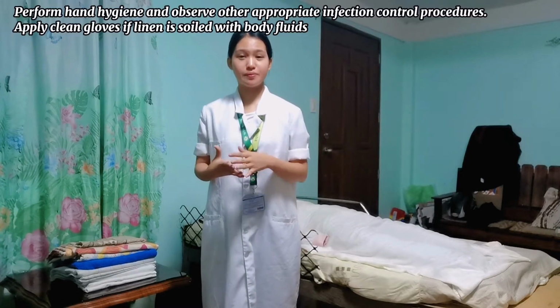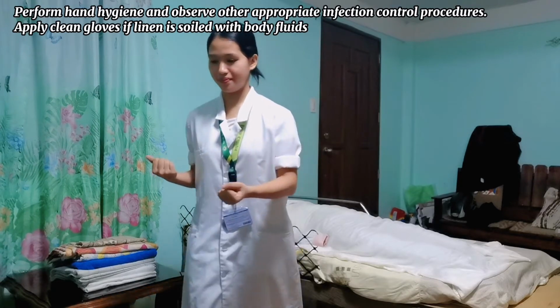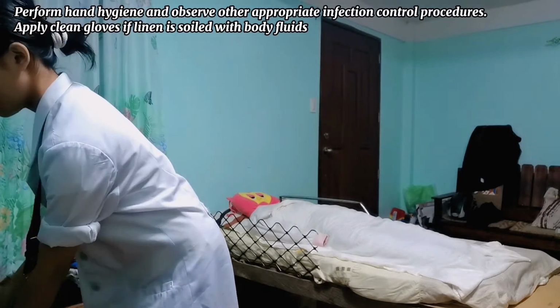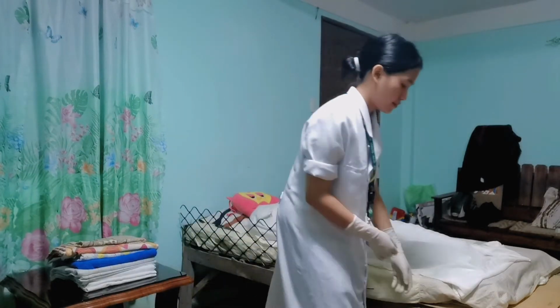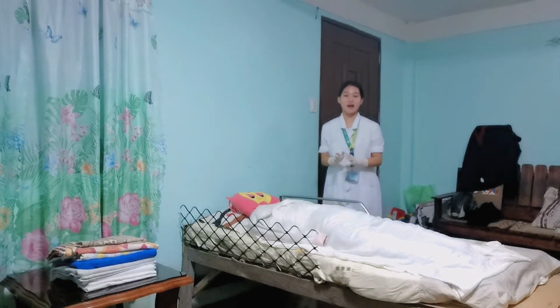The next thing that we will be doing is to perform hand hygiene and apply clean gloves. After performing hand hygiene and donning of gloves, I will be going to lock the wheels of the bed and adjust the height of the bed to a comfortable working height.